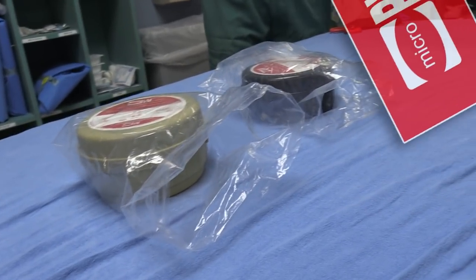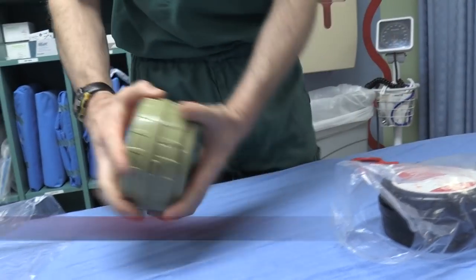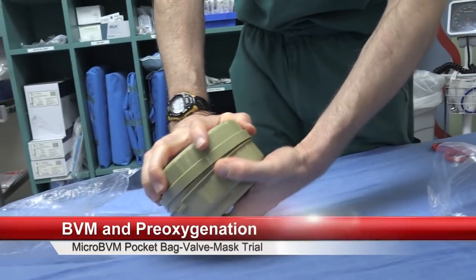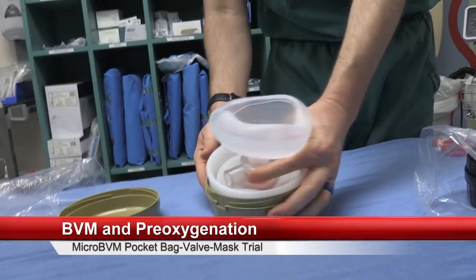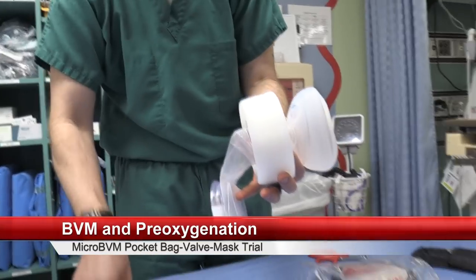So we have some bag valve mask samples that were sent to us for evaluation, and we're kind of fascinated by them. Try manually first, just see if it does. Oh, that's easy. They unscrew. Okay, go ahead and open it up then. There's your mask, and it's got your oxygen tubing.